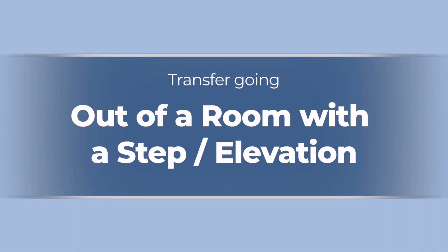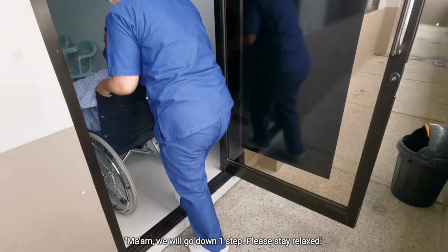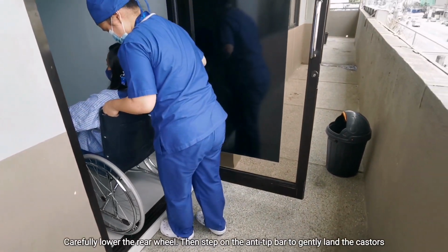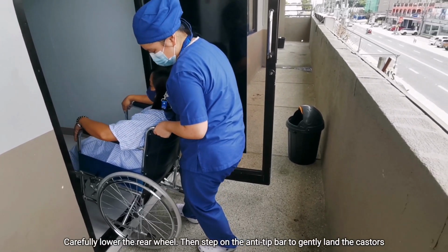Transfer going out of a room with a step or elevation. Ma'am, we will go down one step. Please stay relaxed. Carefully lower the rear wheel, then step on the anti-tip bar to gently land the castors.